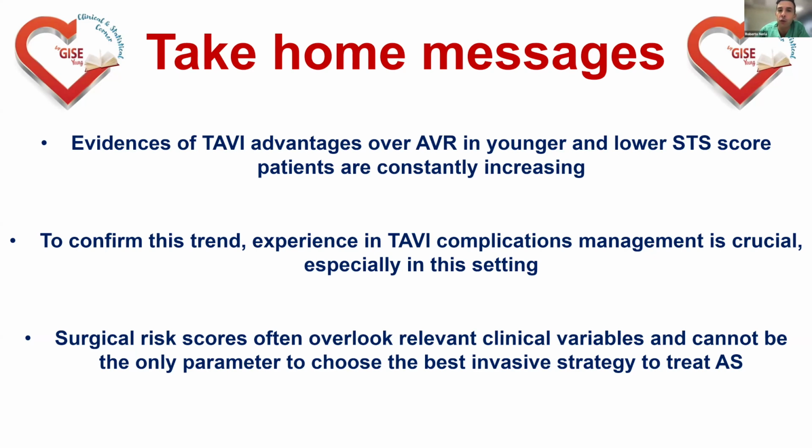And if you want me to conclude with take-home messages, first of all, I want to thank you for this very nice invitation. But I think that Antonio showed us a very nice example of what we are going to face in the next future, because we know that the evidence of TAVI advantages over aortic valve replacement in younger and lower risk patients is increasing and will increase in the next future.